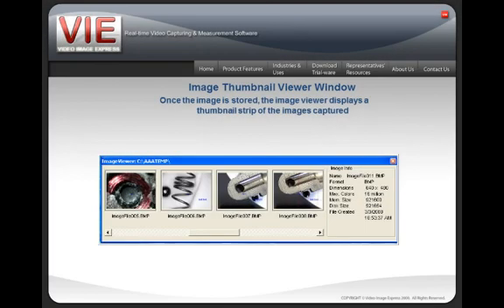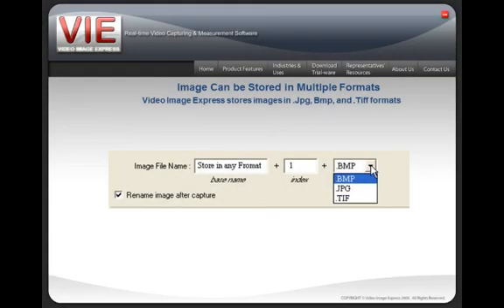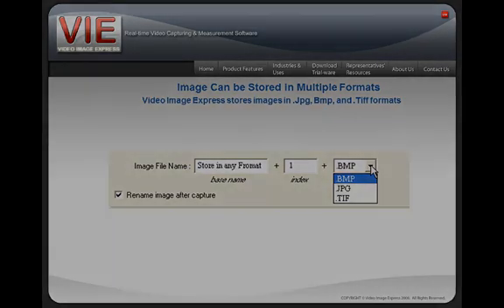After capturing an image, a thumbnail viewer will appear which will display all of your stored images. Video Image Express can store images in a wide variety of formats such as JPEG, Bitmap, and TIFF.